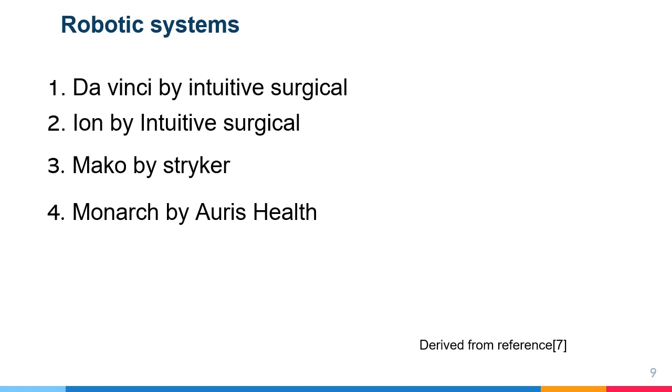Robotic surgery systems offer precise, accurate, and easily replicated results that can greatly assist surgeons and improve patients' outcomes. The term robotic surgery is often viewed as an autonomous robot completing the procedure without human interaction. However, it is important to note this is not the case in most systems. Robotic systems are guided by professional certified surgeons to facilitate the procedure being conducted. These systems are proliferating rapidly as of recent, and the Food and Drug Administration is clearing more each year.